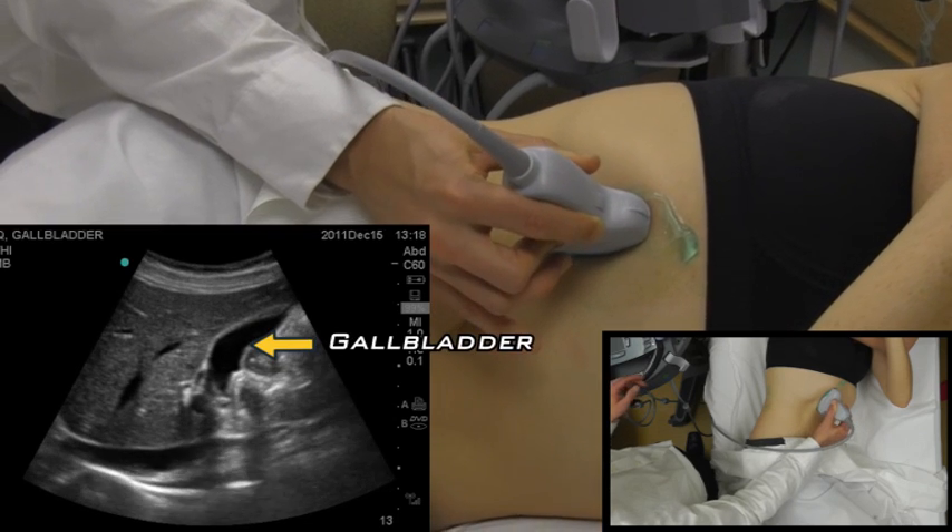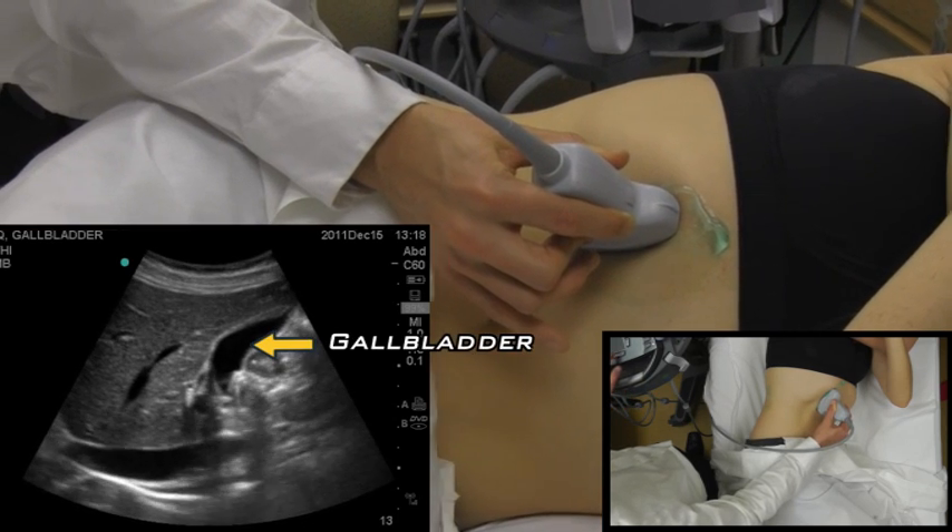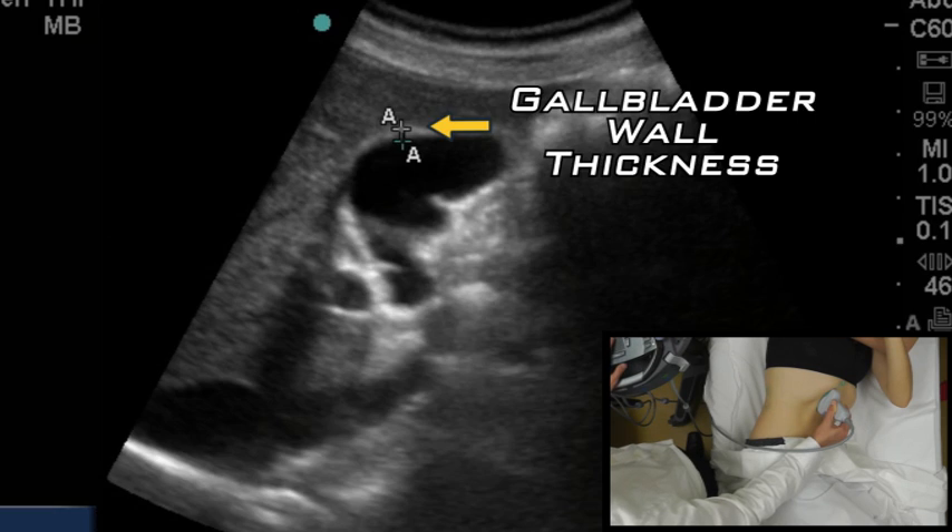You're going to want to measure the wall thickness here. You freeze it, you measure, and you see this is less than three to three and a half millimeters, which is normal — no signs of cholecystitis with the wall thickness there.